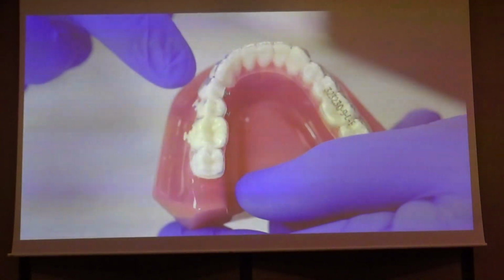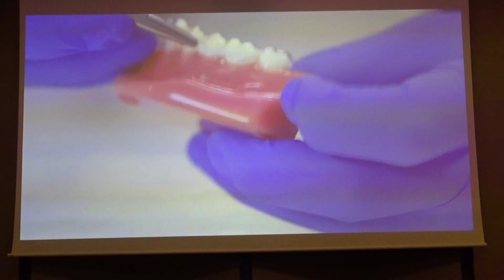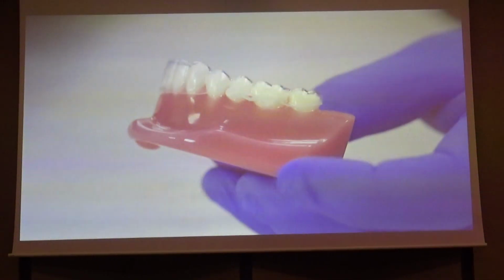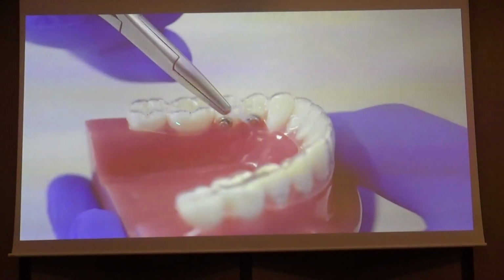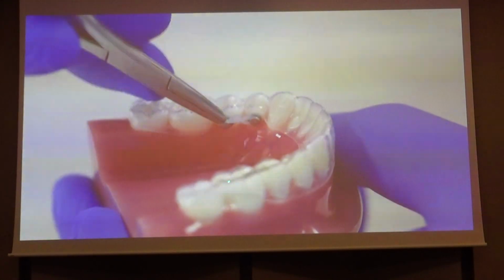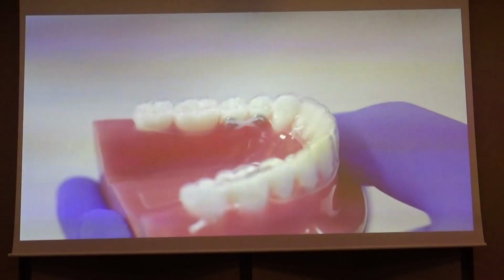That's the mechanics that we used, right? Buttons in the buccal and the lingual, and power chain. Cái lực, cái cơ chế lực mà chúng ta áp dụng trong ca này. You can check the cutouts that we have, the button cutouts. Mọi người hãy quan sát cái vị trí các khay và cái button.